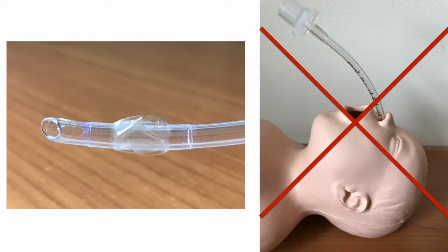The other important thing is your intubation should be oral, not nasal. The septic patient's highly likely to have either coagulopathy or thrombocytopenia, so the last thing you want to do is cause bleeding that's going to prevent you putting the tube in. Likewise, some places have a practice of intubating orally and then electively changing the tube to nasal. These unstable patients, you shouldn't be doing this. Once you've got your oral tube down, job done, the last thing you want to do is put the child through unnecessary intubation where they're likely to deteriorate again by just changing the tube from oral to nasal.